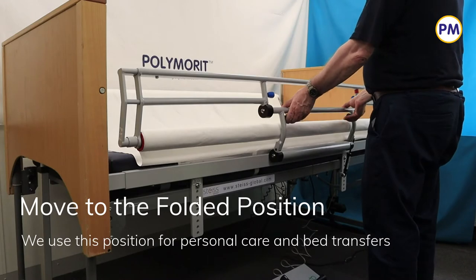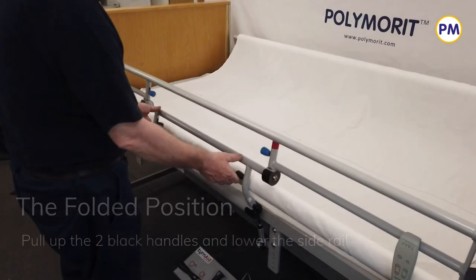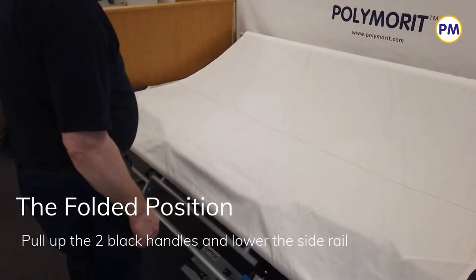We use the folded position for personal care and bed transfer. When the roller is at the bottom, lift the black handles and allow the rail to pivot down, controlled by the gas strut.